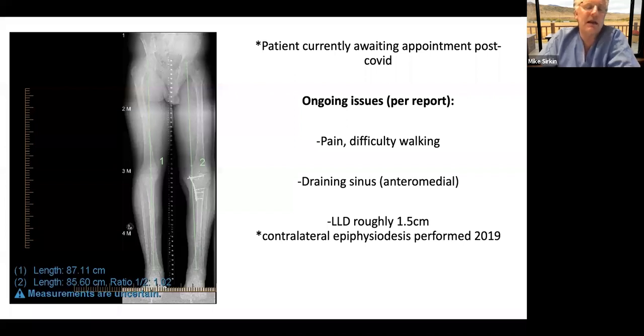The trick to get it out is not by using osteotomes, because that usually just breaks the bone apart that's around it. I use an Ultra Drive or an Oscar or one of the ultrasound things that total joint people use. And I cut my spacers up into a few pieces so that I can take them out gingerly and leave the rest of the very fragile bone in that area.